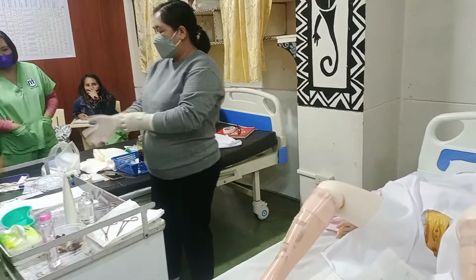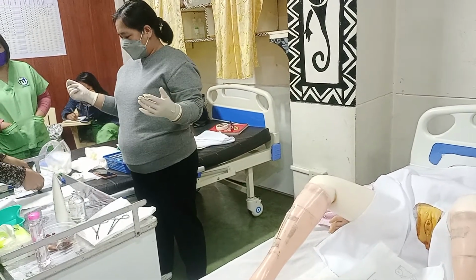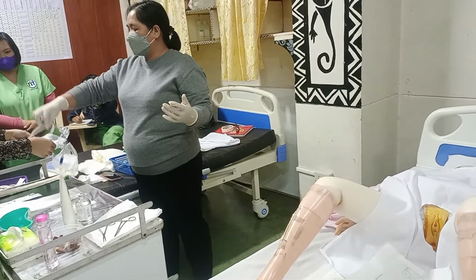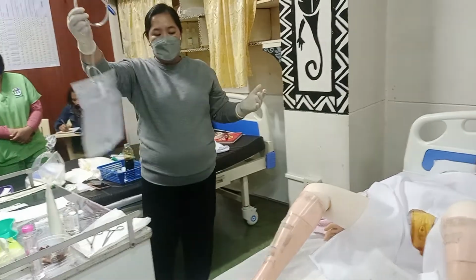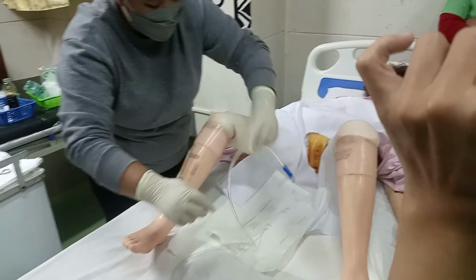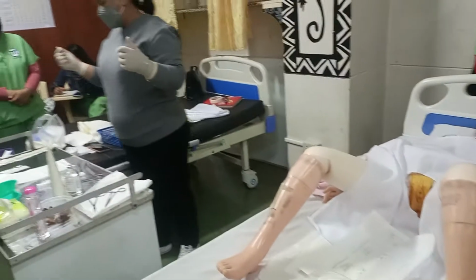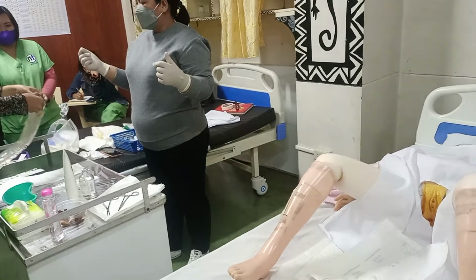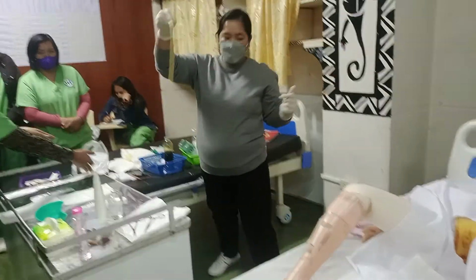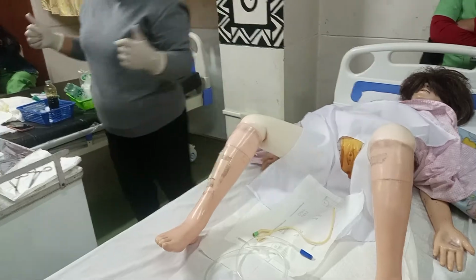Paserve ako ng urine bag. Kunwari naka-cellophane dati. Thank you. Okay? Ang hahawakan nyo lang yung tube. Yan. Make sure na yung tube nasa sterile area. Alright? Next, urinary catheter. Okay? Doon lang din siya sa sterile area.